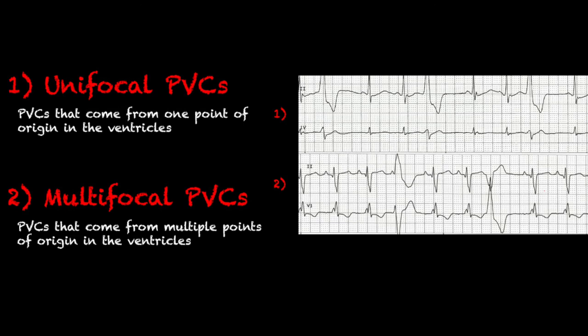On the screen here I have two different strips. Strip number one shows unifocal PVCs — PVCs that come from one point of origin in the ventricles, so all the PVCs look very similar. And in number two, you have multifocal PVCs — PVCs that come from multiple points of origin in the ventricles. You can see in the number two strip that they look very different; they're both PVCs, just coming from different areas of the heart.